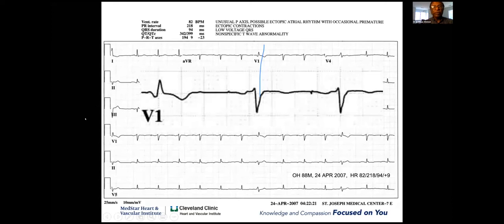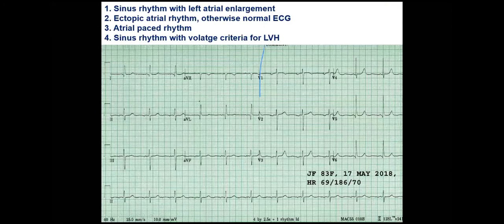Thank you. Vigbhai, I have done this trick with the calibration, 25 millimeter speed. Then I go to 50 and make an SVT look like VT.